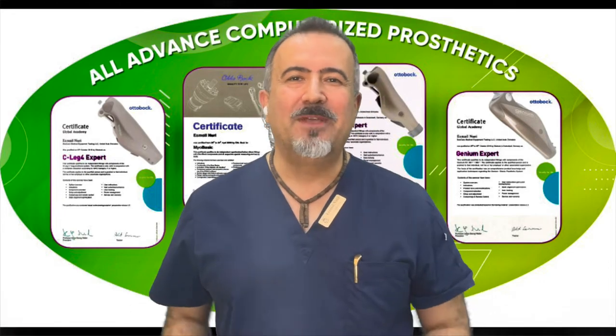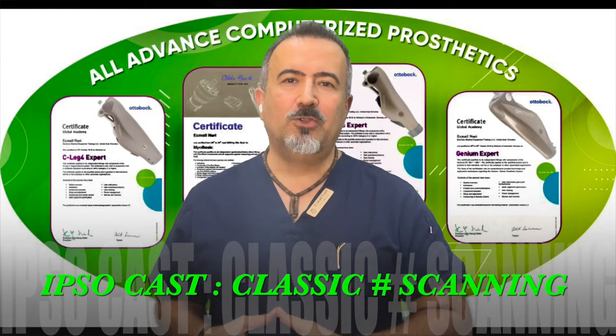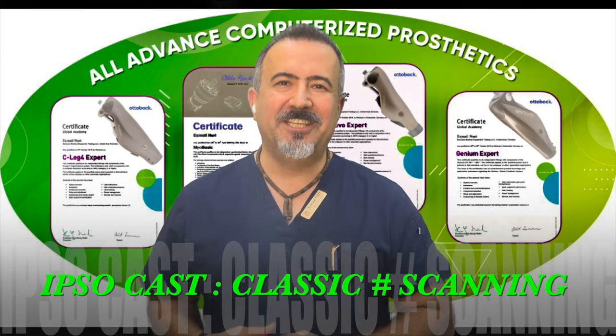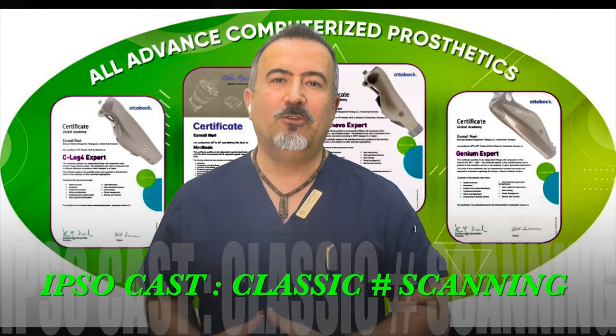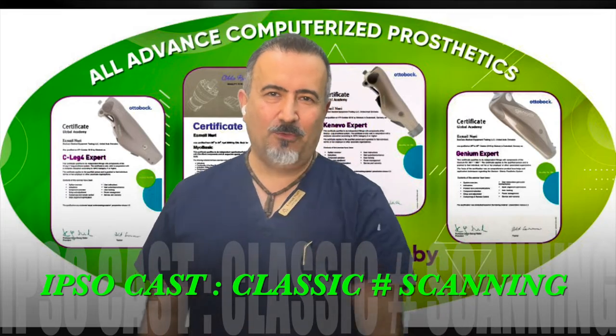Welcome back to BestCare Forum. In the first video, Mr. Hartman will show us how to do the casting in the classic way. When you continue watching, in the second video, you will see the same casting for bologna with the scanning. Let's go for it.